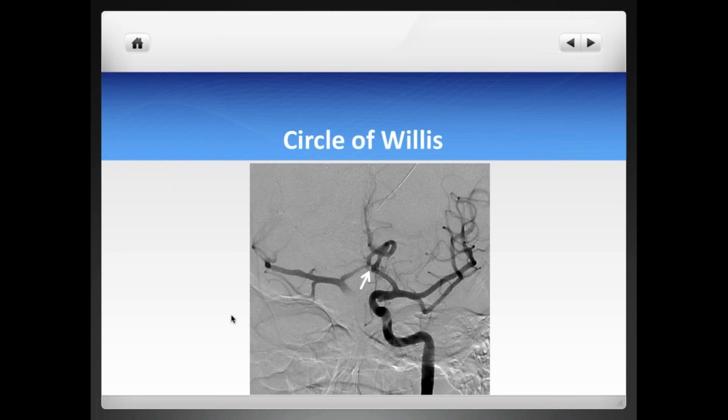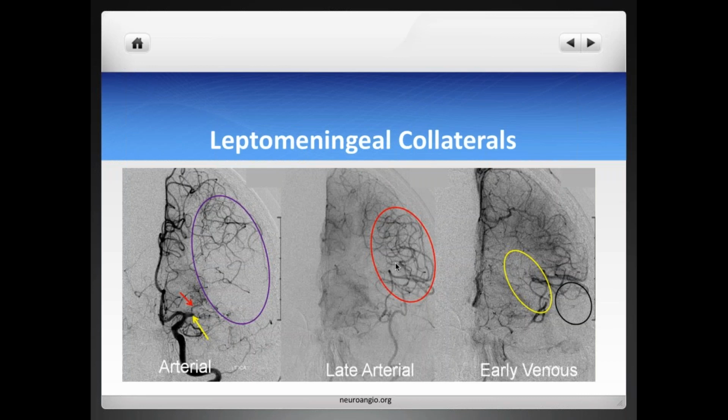So talking about the circle of Willis here, of course, you can see from this graph that even if you would have a complete right ICA occlusion in this case, by injecting contrast in the left ICA, you get full opacification of the contralateral MCA and contralateral ACA. And in fact, we know for sure that some patients can live a whole life with an occluded ICA, assuming that the intracranial vasculature is patent, because if you have a good ACOM, chances are that you're going to keep the perfusion in that right hemisphere going. And that's in terms of the circle of Willis.